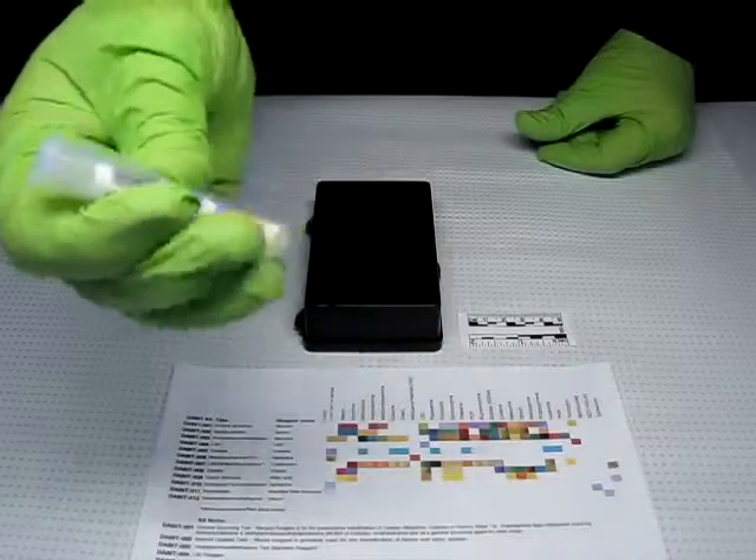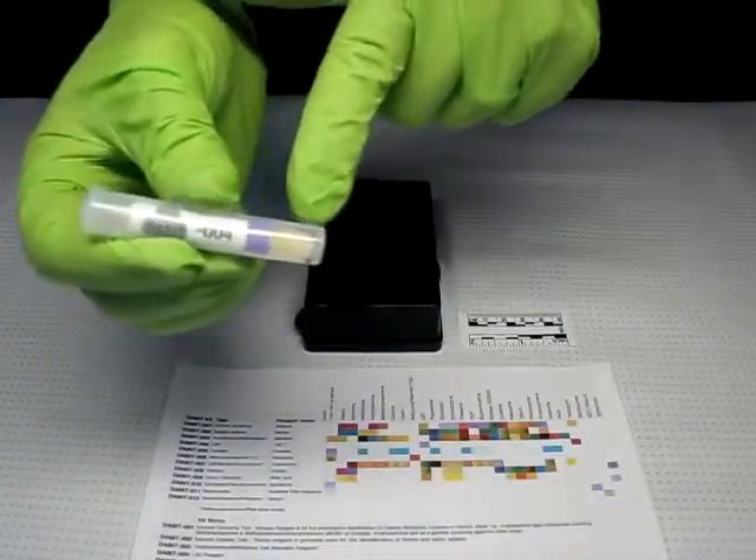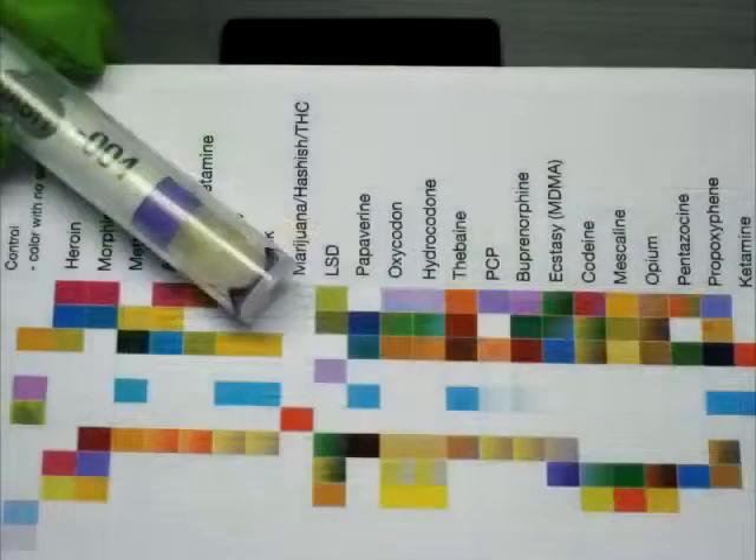Look for a color change on the sampler tip or the material sampled. Consult with the color chart. In this case, a purple color indicates it is positive for LSD. Refer to the instructions to verify these steps and the results.